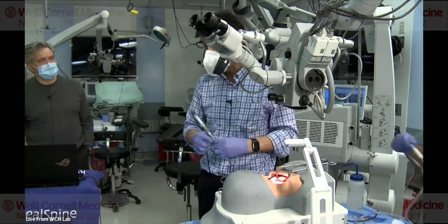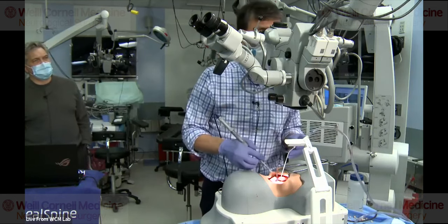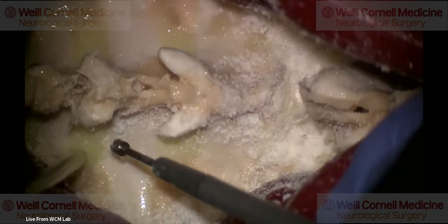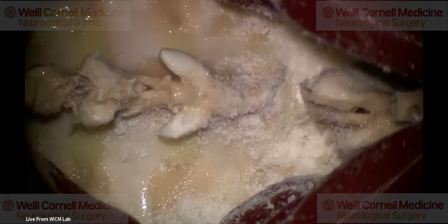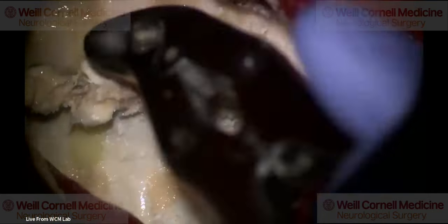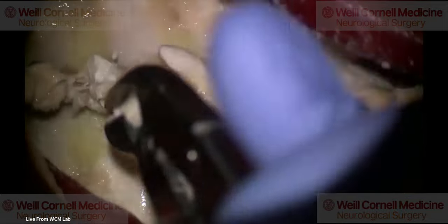No, I think that laminectomies work well in terms of neck pain. And you can do a 1-level laminectomy, 2-level laminectomy, and I will do 1 or 2-level laminectomies without doing a laminoplasty. But when I go beyond that, I think a laminoplasty does have advantages. Now, I'm going to do a laminoplasty of, let's say this is 4 and this is 5. So I'm going to pretend that that's 7. And for the sake of time, I'll just do 2 instead of a typical 3.